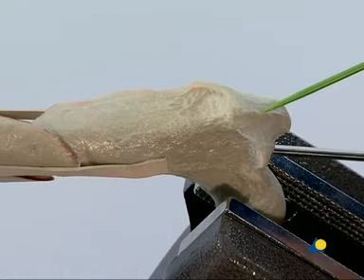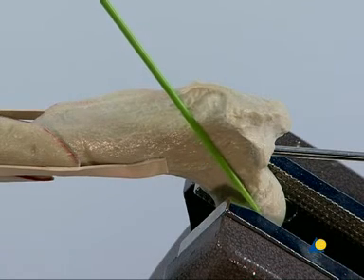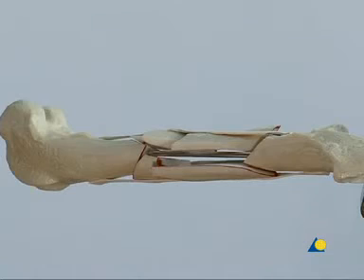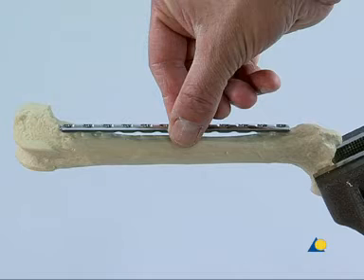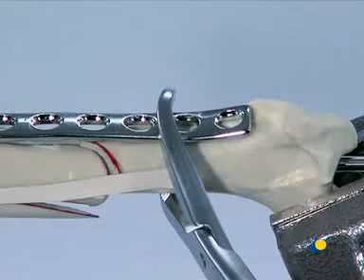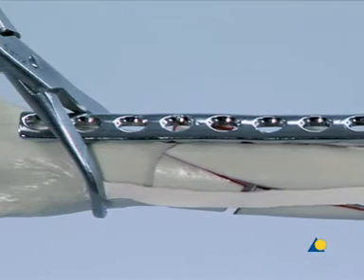The landmarks are the greater trochanter, the femoral neck, the femoral condyles, and the linea aspera, which starts at the caudolateral aspect of the femur. A 12-hole 3.5 LC-DCP is contoured to the lateral surface of an intact femur. In a clinical case, a radiograph of the uninjured leg would be used. The contoured plate is secured with the toothed reduction forceps to the proximal and distal segments of the bone.